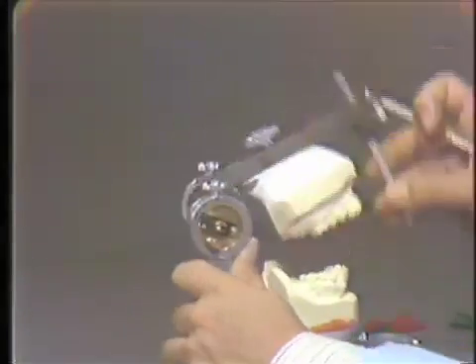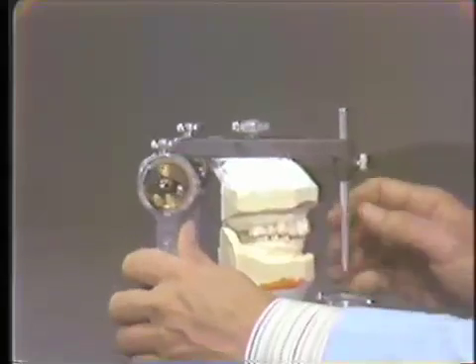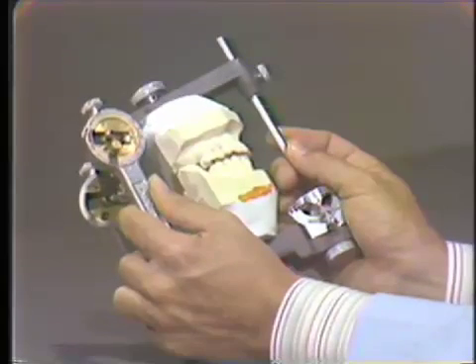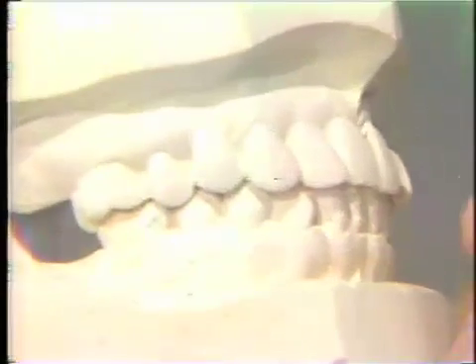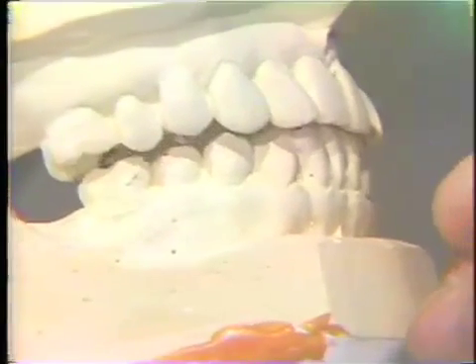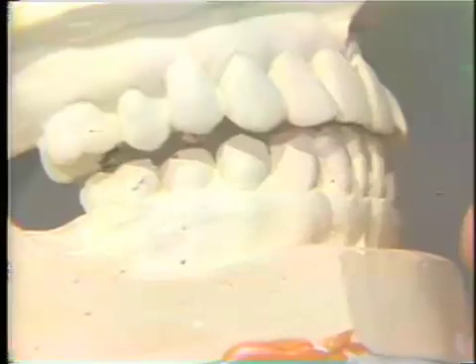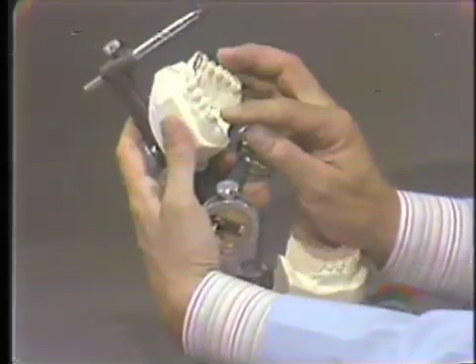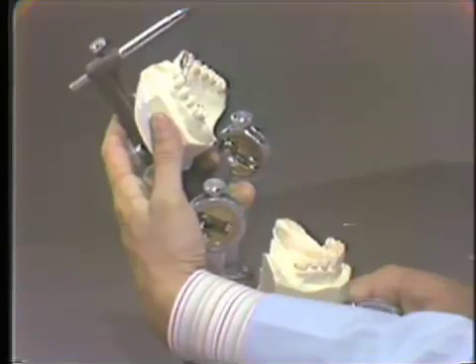There is a steep incisal guidance on the patient, so I wouldn't expect there to be a balancing interference of any significance at all, and indeed the analysis bears this out. You can see that on the balancing side in the molar area it frees up rather nicely with no balancing contact. If we had a balancing contact, it would have been indicated in the red indicating material. I have none whatsoever — what I do have is that first centric relation prematurity. So there is no balancing interference for us to deal with.